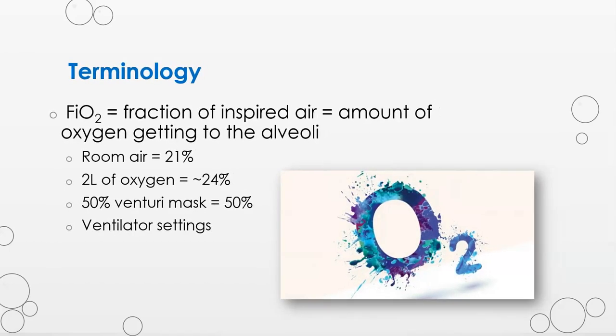The FiO2 is the amount of oxygen that is provided to the patient, either through room air ventilation at 21% or through supplemental oxygen administration. To prevent oxygen toxicity, the goal is to provide the lowest FiO2 possible to be able to maintain the ordered oxygen saturation, typically greater than or equal to 92%. For a patient with ARDS, the goal would be greater than or equal to 90%. Oxygen toxicity can alter capillary membranes, and you know from the inflammatory response, this can be very detrimental. On mechanical ventilation, the rate is also set. I will address that in a bit.